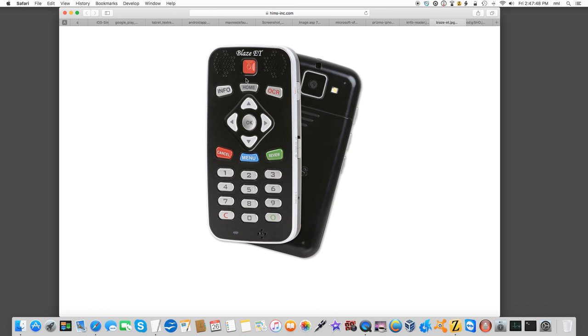This is a screenless talking media player. It's called the Blaze ET. It's developed by a company called HIMS, which is the Human Information Management Service of Korea. But they've had an office here in Texas for the last several years. So the device runs a custom version of Google's Android operating system. Because of the open nature of Android, that opens up a slew of options for development for this thing.